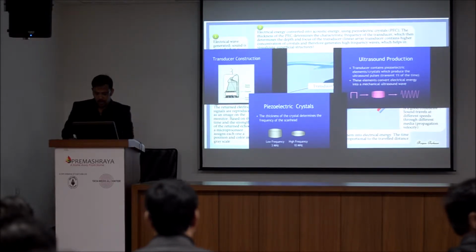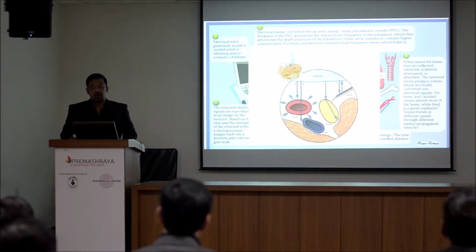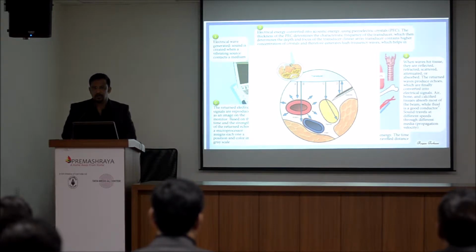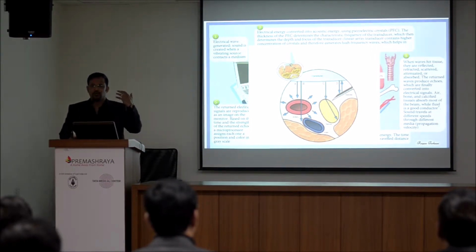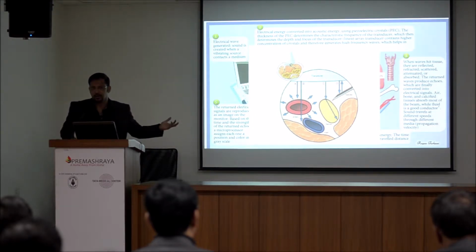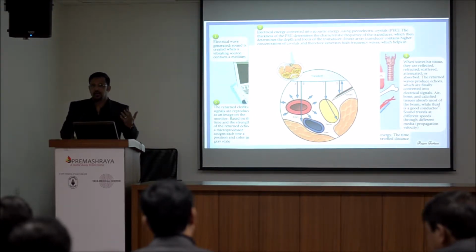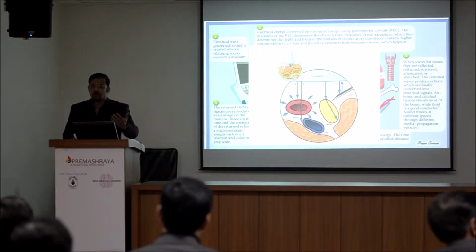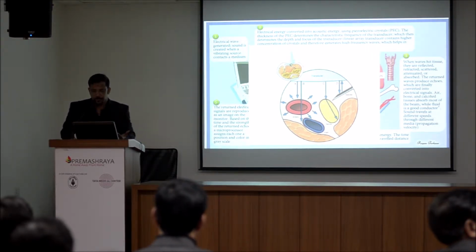Now this sound wave travels inside the body, and it will either be transmitted, reflected back to the probe, or scattered, depending upon the tissue which it hits and the acoustic impedance, which I will tell later on. It decides the nature of the wave, and ultimately that wave gets absorbed as heat or gets attenuated.